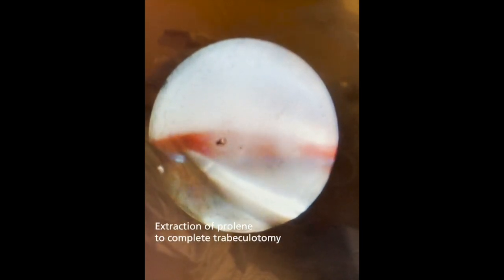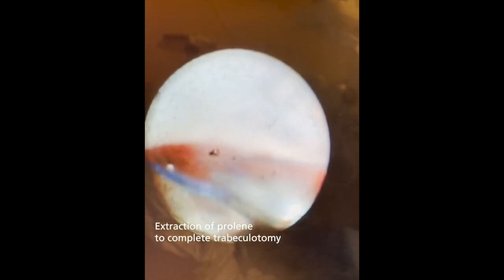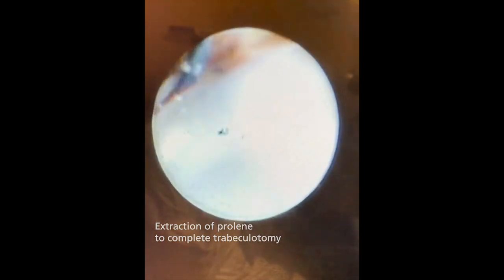And conversely, if there's no pain and we lose the feedback, there's a chance that the suture has gone into the anterior chamber. We're able to feed the suture a fair amount and then extract it from the eye, completing the goniotomy or trabeculotomy portion of the surgery.